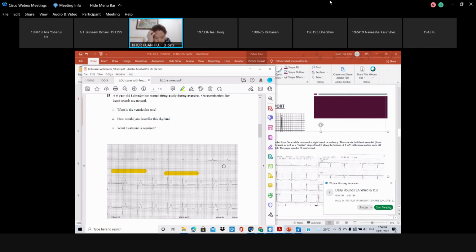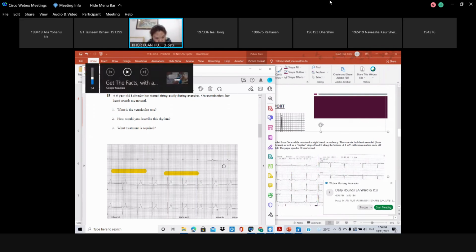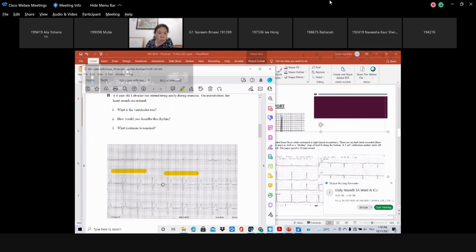Any question? Hello, doctor, I have a question. There's also no Q wave, right, in this ECG? No P wave, then QRST. Q is just here.